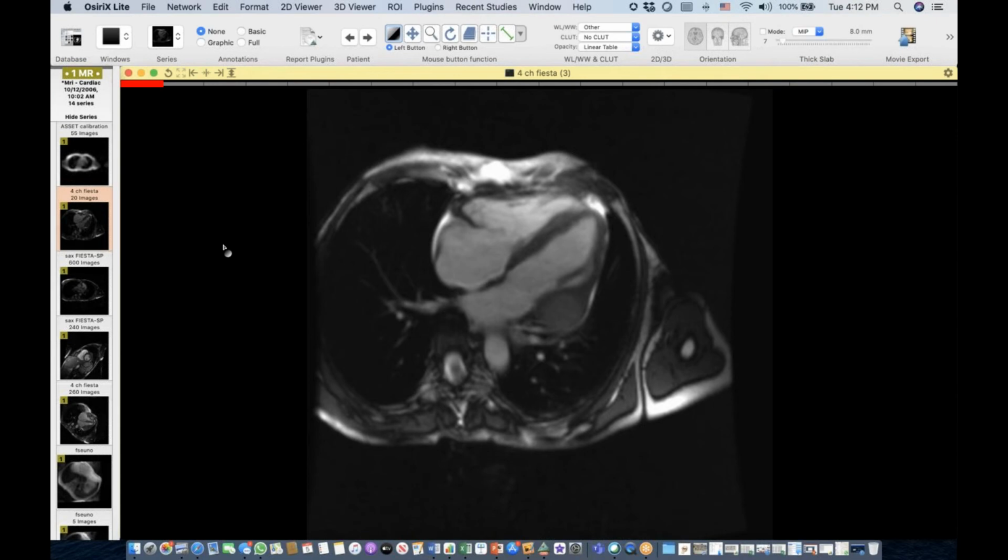That's a great question. At Mayo Clinic, we tend not to believe that radiation's an issue. So we actually time it like a coronary CTA, and then I usually do the AP and then do, as quick as possible, a gated delay just to the heart with dual energy. And that allows you to get kind of a late enhancement look. Particularly if it's something like a thrombus in the right atrium, the fact that on the late dual energy imaging there's no uptake in the thrombus, for example, or on a valve, makes you a lot more confident. Or, if it's a hypervascular tumor, it often washes out like a renal cell. So that's how we tend to do it.